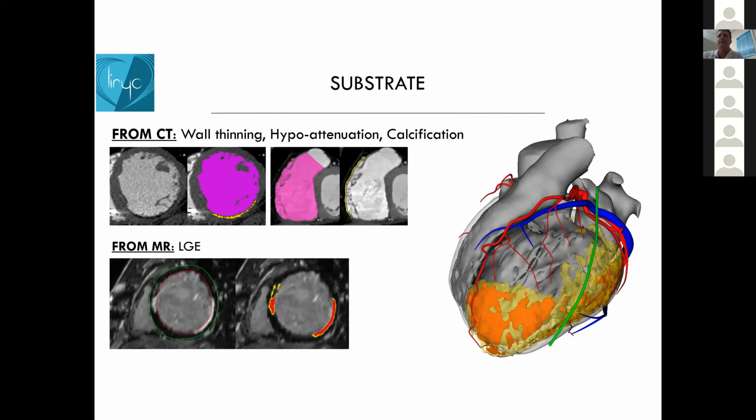Here's some scar there, and then visualizing the substrate. What I like about CT compared to MR, and we're lucky here at MUSC, the radiology group here actually came from the Brigham and had a lot to do with developing late iodine enhancement, and has really given nice images. And what I like about it is it's more easily reproducible and more accessible than MR is, at least in our center, and probably in most centers.